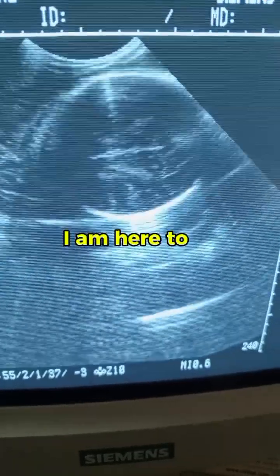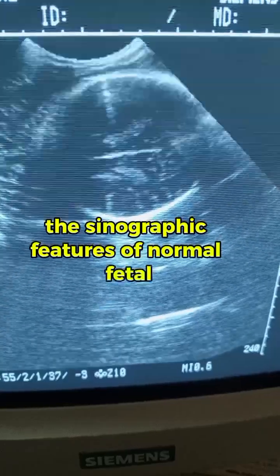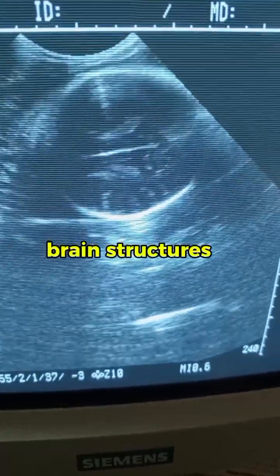I am here to demonstrate the sonographic features of normal fetal brain structures.